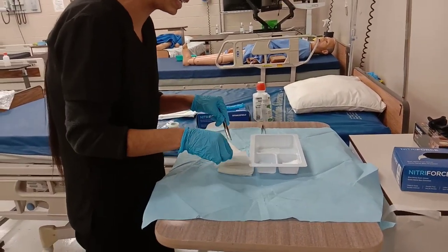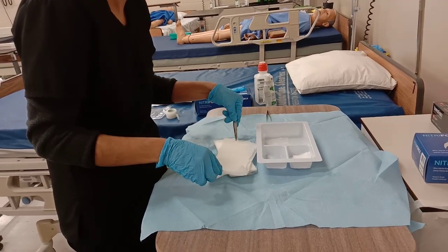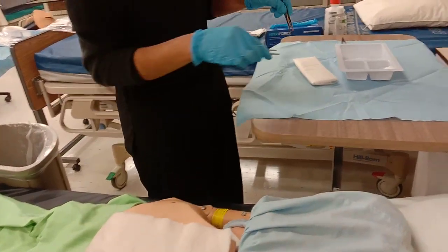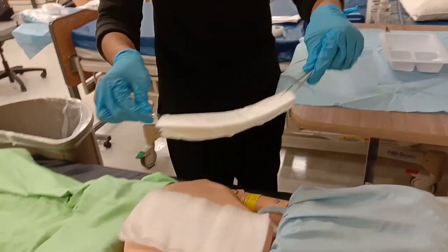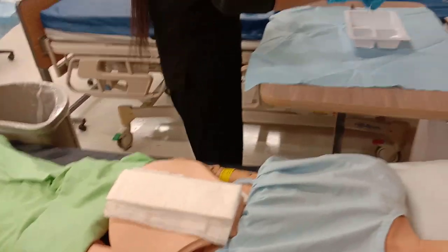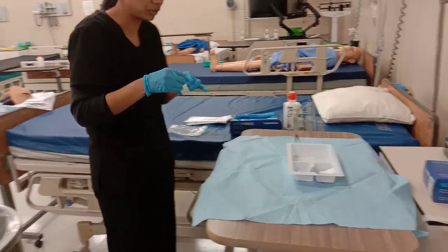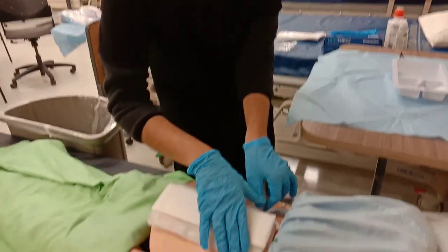Now I'm going to apply the sterile gauze, which is dry, over the wound. Now I'm going to apply the abdominal pad. The absorbent side is towards the inside. Now I'm going to place my forceps in the similar way. Now I'm going to secure my wound with the bandage.